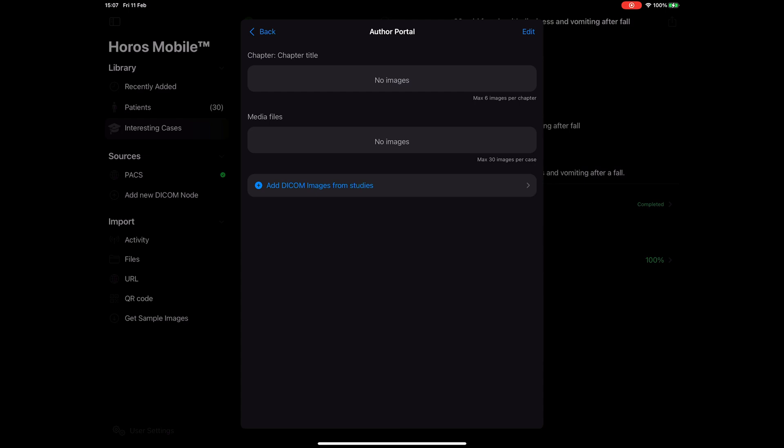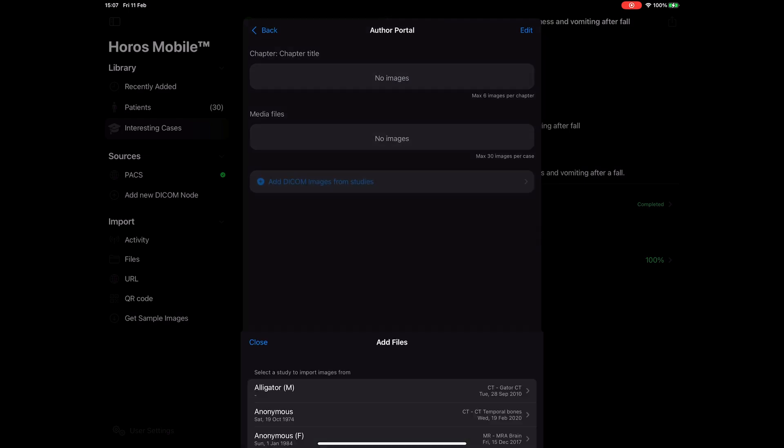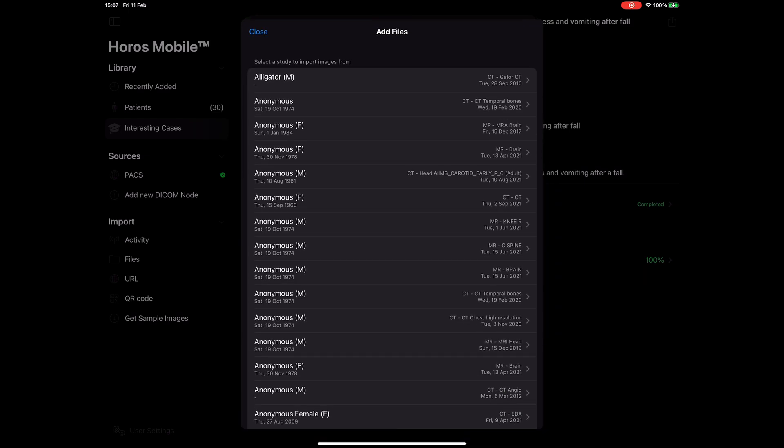Let's add some images. Currently, our media pool is empty, so we will add some images from our database. When we tap on the add DICOM images button, we are presented with a list of all the studies that are saved in our database. Let's go ahead and select one.